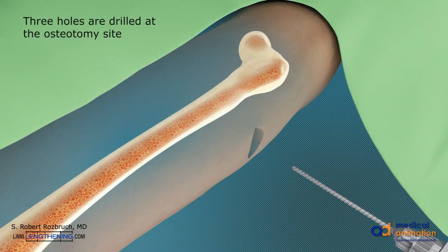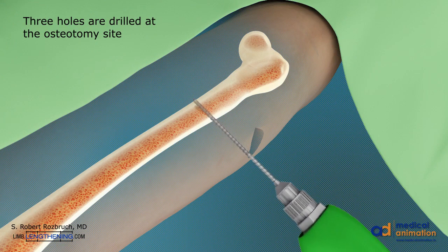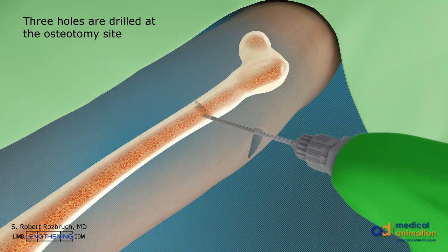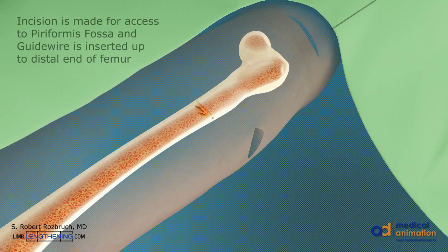After a 1 cm incision is made, 3 drill holes are made at the osteotomy site. A 2 cm incision is made in the buttock for access to the piriformis fossa.